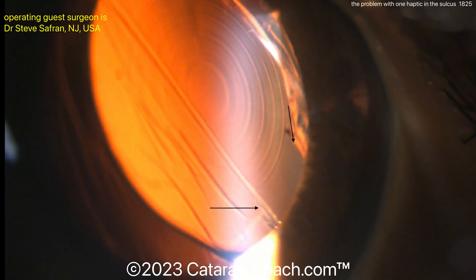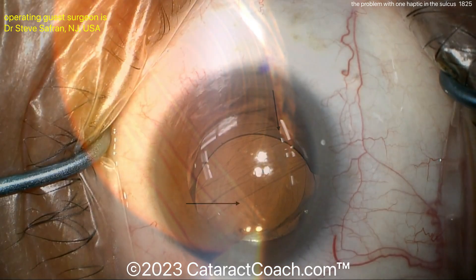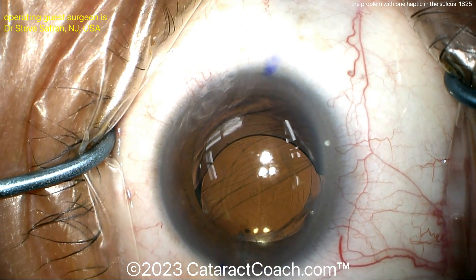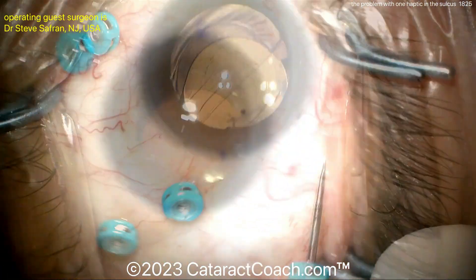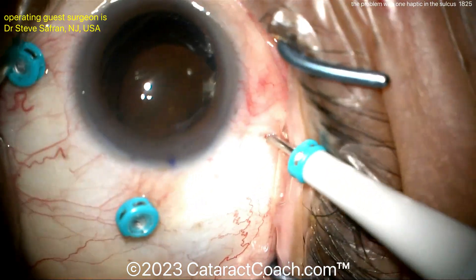Yes, in fact a manual capsulorrhexis can be much stronger than a femtosecond laser one. Look at that case — very decentered lens here. The surgeon is going in with some trocars, pars plana, looks like 25-gauge.